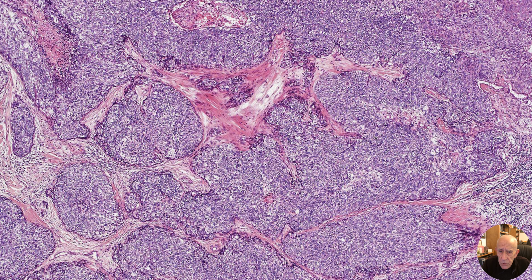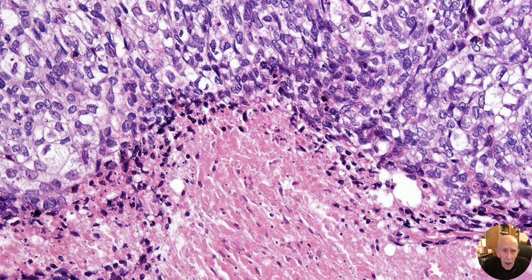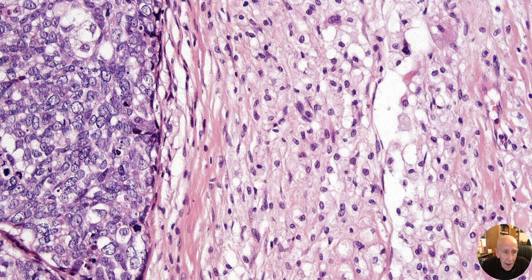This is deeper down just to show you how extensive the tumor is. And there's a lot of necrosis. Now, it's quite interesting, when you don't have really well developed sebocytes, you can end up thinking these are clear cells, and so you might be trapped into thinking this was one of the differential diagnoses, like, for example, clear cell hidradenocarcinoma or balloon cell melanoma. And this is an interesting feature which can catch the unwary.